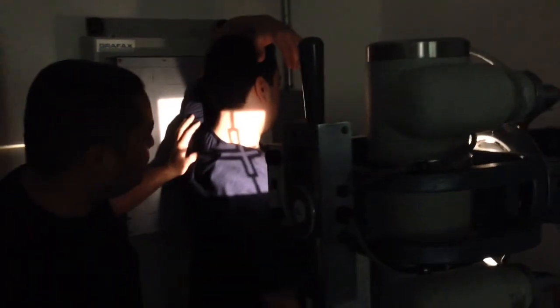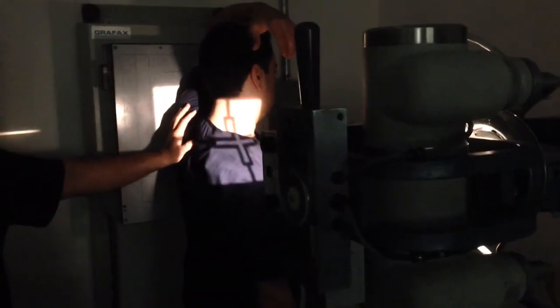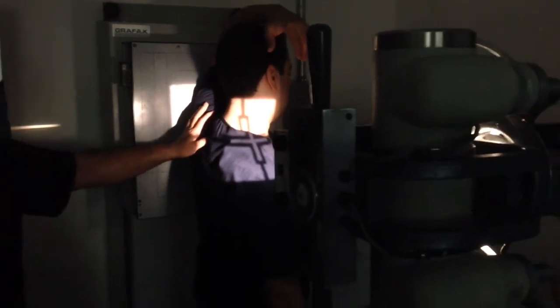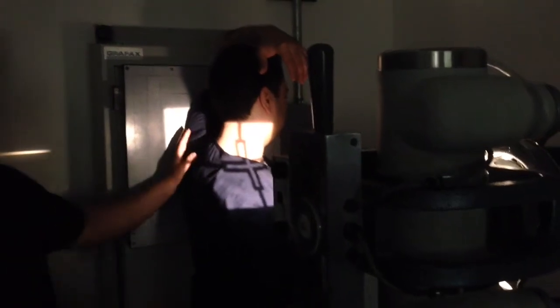Okay, got 10 by 12. C7-T1. So this is the cervicothoracic. This is swimmer's. If they can't depress the shoulder like this, then you raise this and you angle. That's not on your test or anything like that, but when you get out into the world, that's what a lot of people are going to be doing. All right, relax. Arm down.